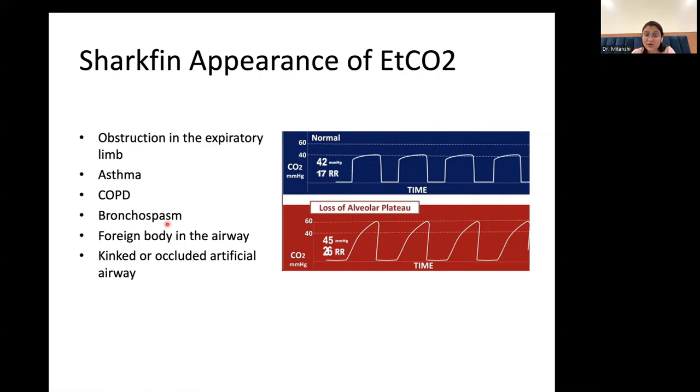So bronchospasm can happen and a part of my lung is not being ventilated, right? So that is causing a lot of CO2 trapping and I'm not able to expire it well, and I will go for my treatment protocol to relieve the bronchospasm in a graded format. But you have to remember that this is also causing a lot of retention of CO2 in the body. That can lead to CO2 narcosis and it will cause a lot of other grave issues for the patient.